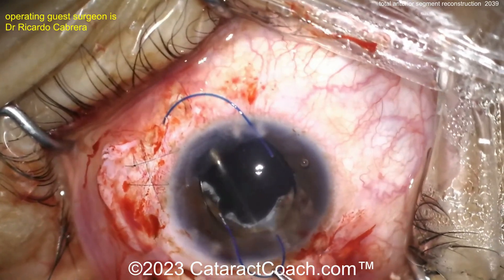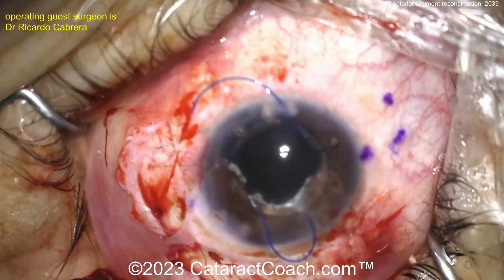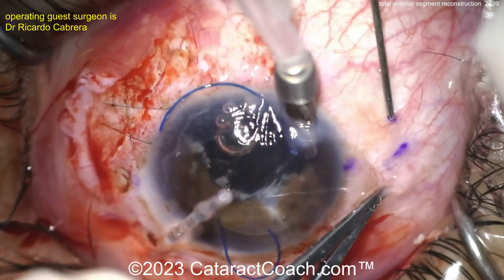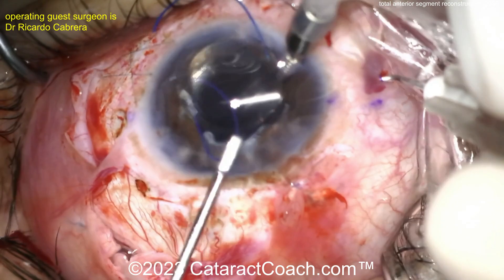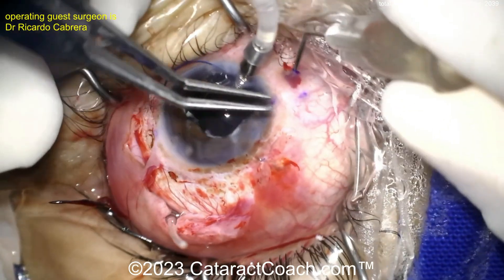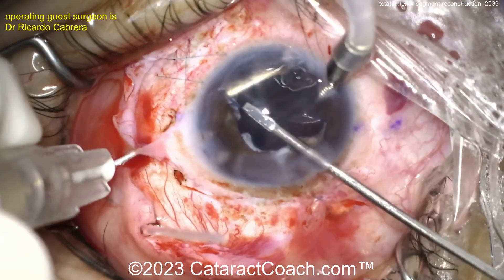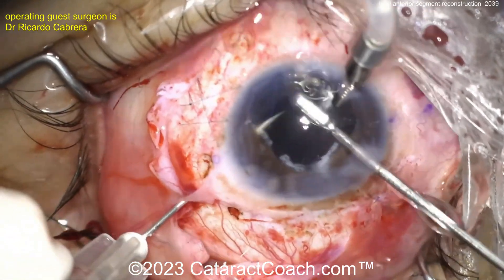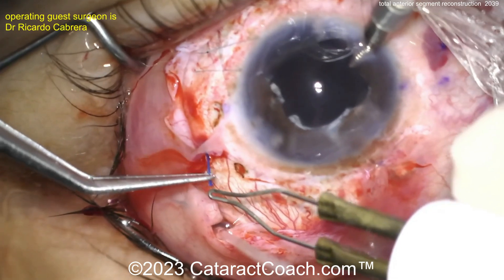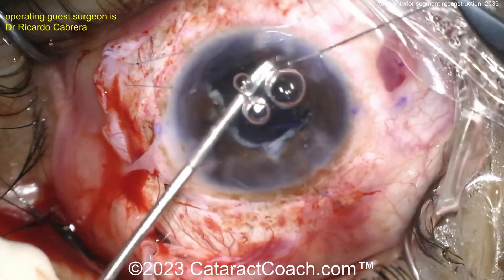There's the three-piece IOL being placed inside the eye. And look at this — scleral fixated IOL. Look at the ink marks being placed. Beautifully done. The video has been edited and is at high speed — we're going to watch the whole thing in five minutes, but this is a one-hour case. Don't think that just because you're an experienced surgeon you're going to get this done in 10 minutes. This is an hour. And this case will take like a week off your lifespan. Make sure the patient actually appreciates that. Externalized haptics — Yamane technique. Nicely done. Place those within the sclera.